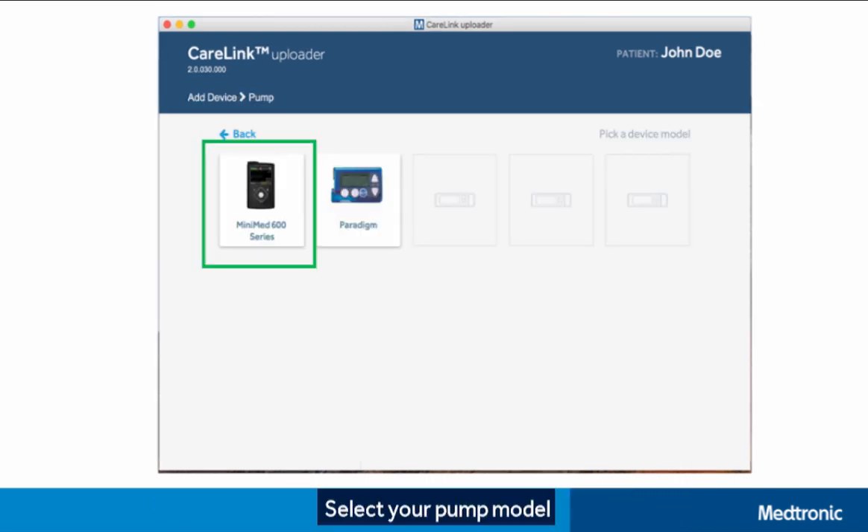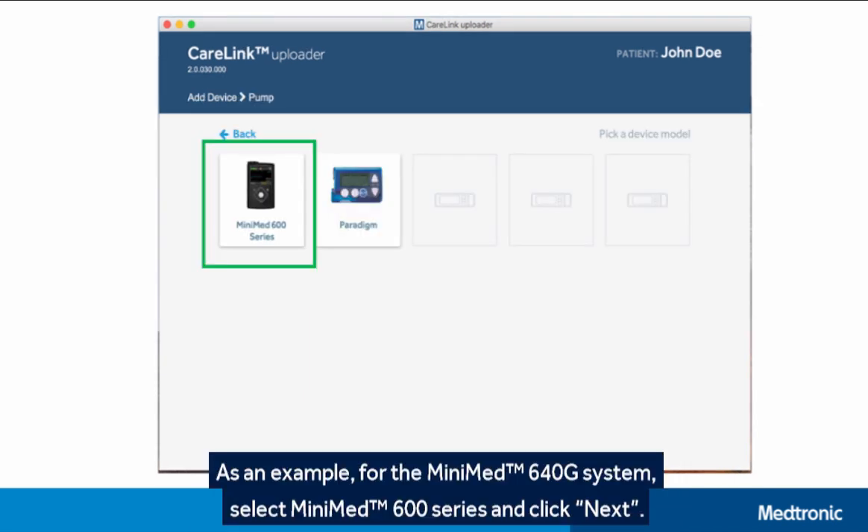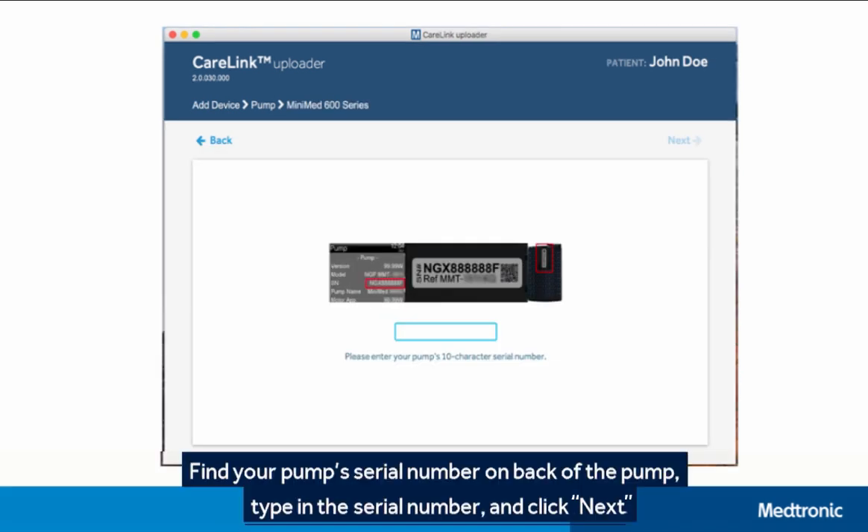Select your pump model. As an example, for the MiniMed 640G system, select 600 series and click Next. Find your pump serial number on the back of the pump, type in the serial number and click Next.